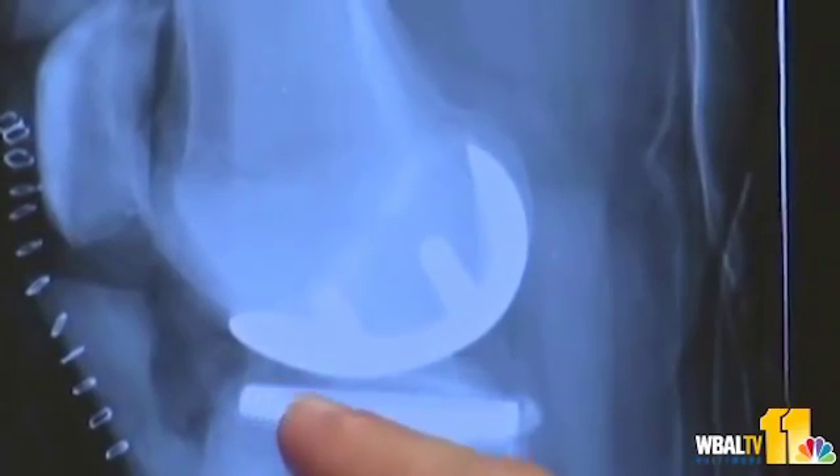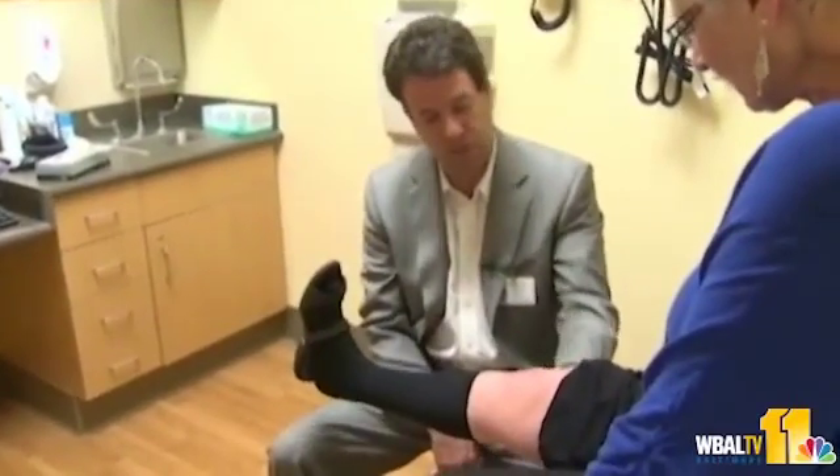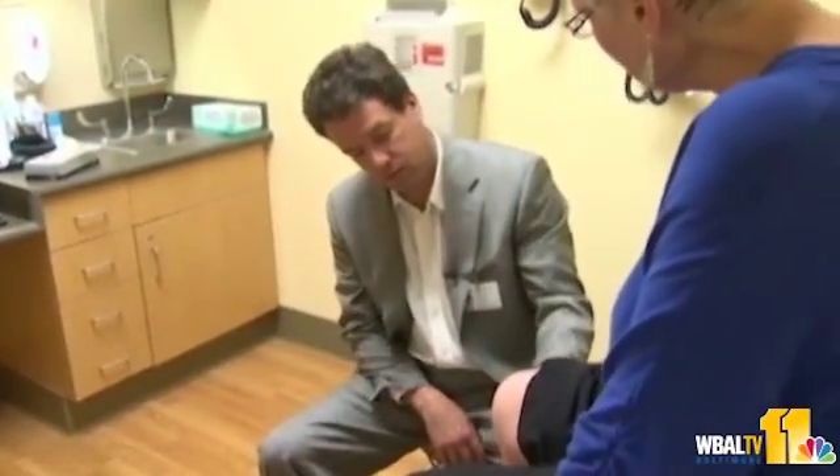You can clearly see those implants on Sue's x-ray. Can you straighten it all the way out for me? Good, that looks nice. Can you bend it all the way back? Good, okay.